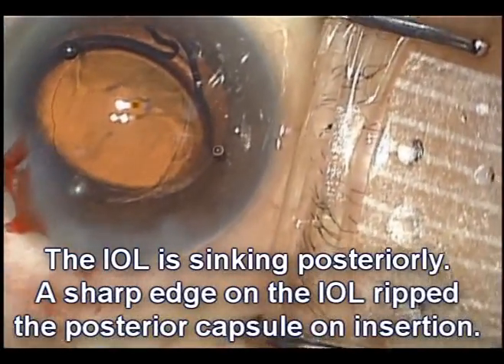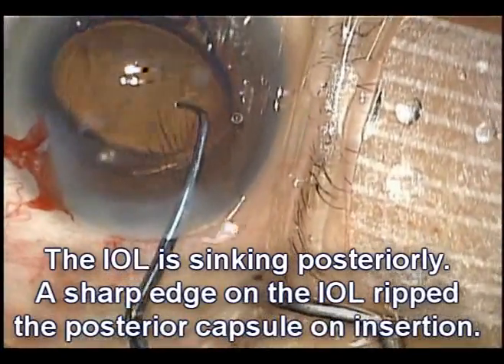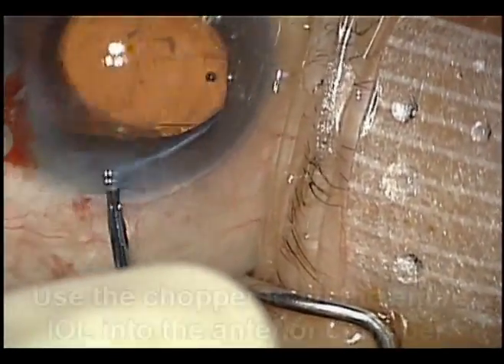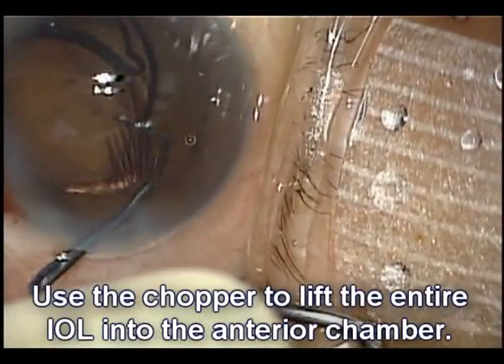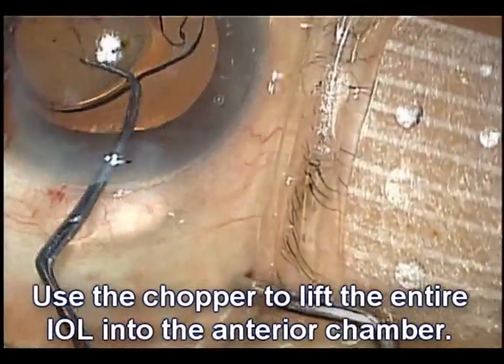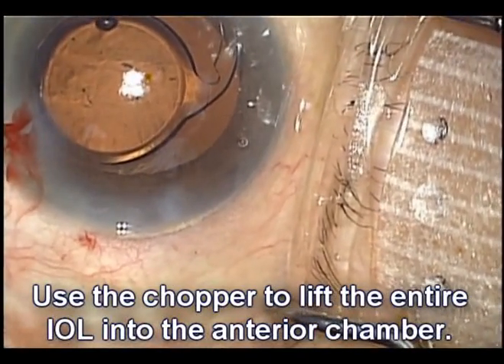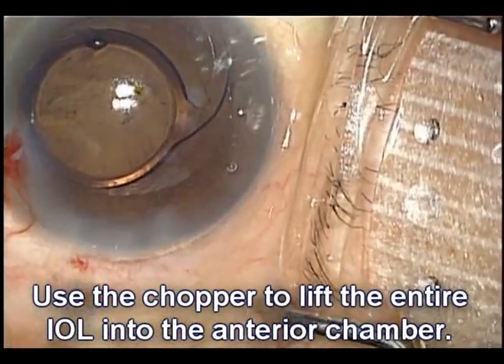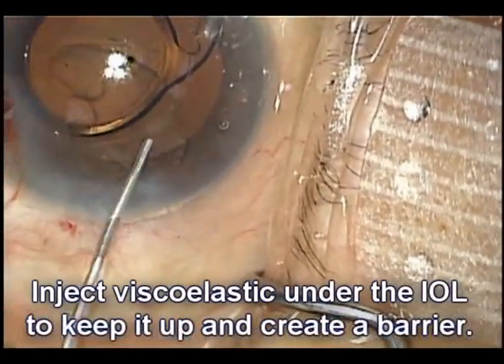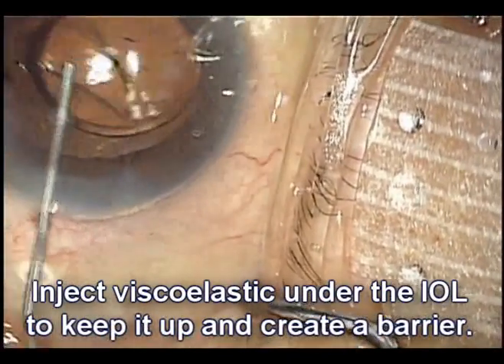This could be a manufacturing defect or perhaps a problem loading the lens. We'll use our chopper to get underneath the lens, get behind the rhexis, under the lens, and lift the IOL back up into the anterior chamber. This is important — we don't want this lens to fall towards the retina. We can inject more viscoelastic behind the lens. This viscoelastic will help keep the lens supported anteriorly, as well as create a barrier to hopefully prevent too much prolapse of vitreous.